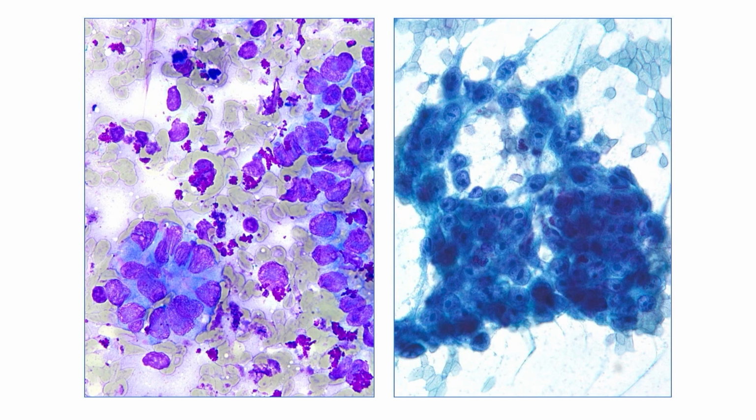This was my case, and I thought that it's an easy case of metastatic adenocarcinoma because there's no colloid. These are gland forming. Look at the macronucleoli. Thyroid lesions typically don't have those features, but maybe I was right, maybe I'm wrong. Most likely I'm wrong. That's why I'm telling you what I thought.